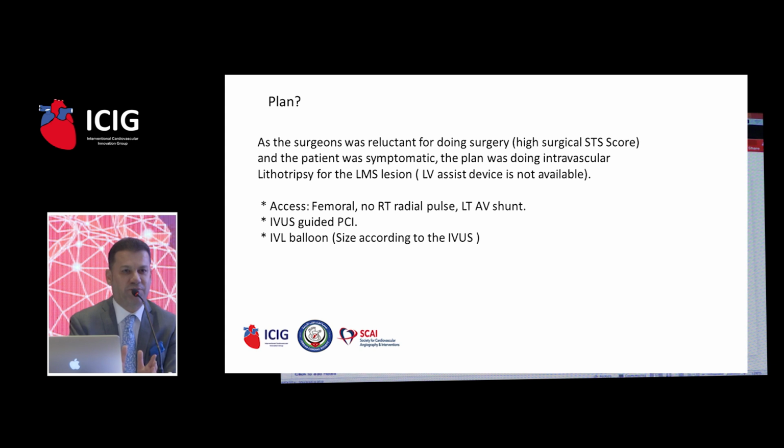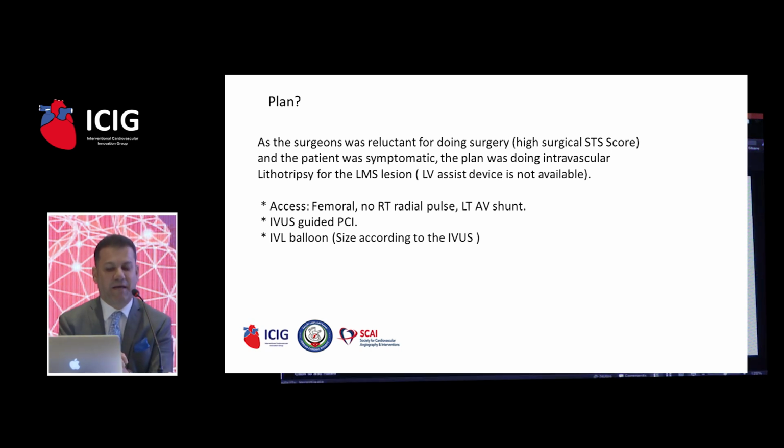For the IVL, a lot of tricks have been discussed with Dr. Belbaz before, but one of the important tips in doing IVL is that the size of the balloon should be 1:1 to the reference diameter of the vessel. It's not like the rotablator. For rotational atherectomy, we use a burr-to-vessel ratio of 0.5 to 0.6 to 1, while for the IVL, the size should be 1:1.